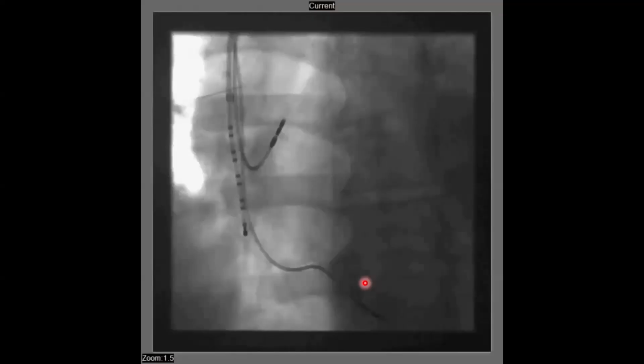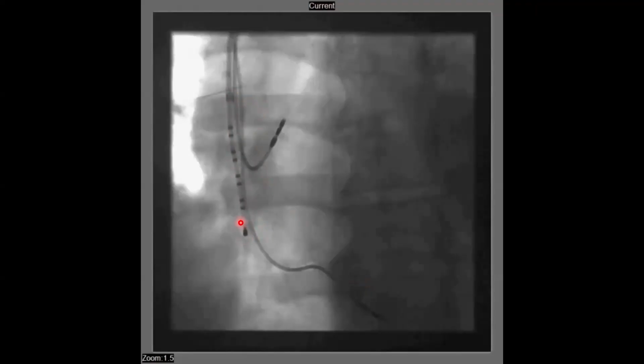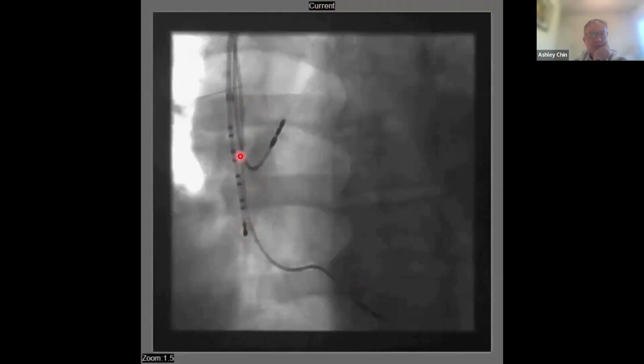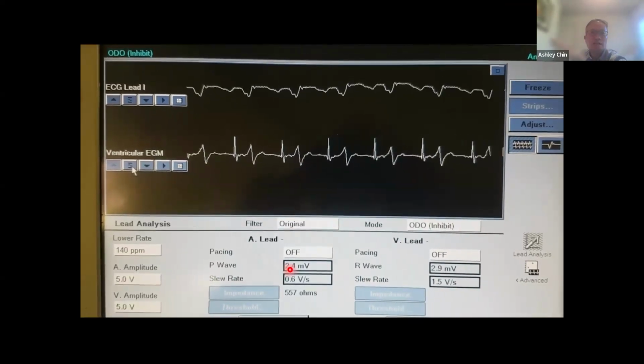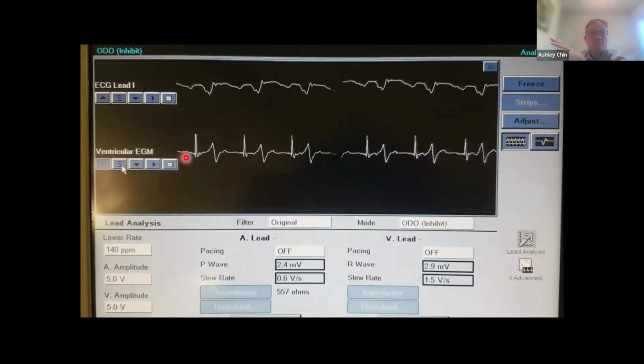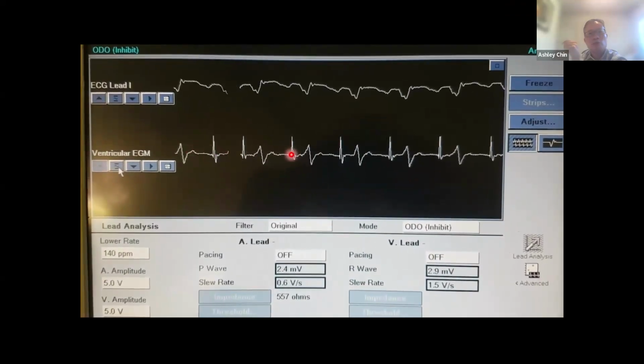This is what an LAO view will look like. So it'll be a decapolar catheter. Remember, we're reading signals here from the distal tip. And here's your outer sheath over there. All right, so I'm going to advance it into the right atrium. And now I'm going to look, and here are the ventricular EGMs. And here I've got a good position; these are what you want to see.